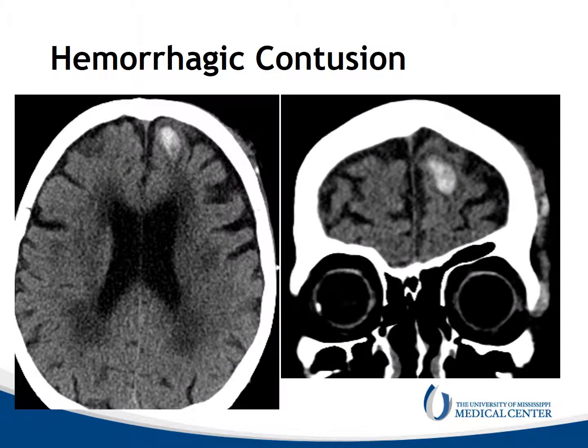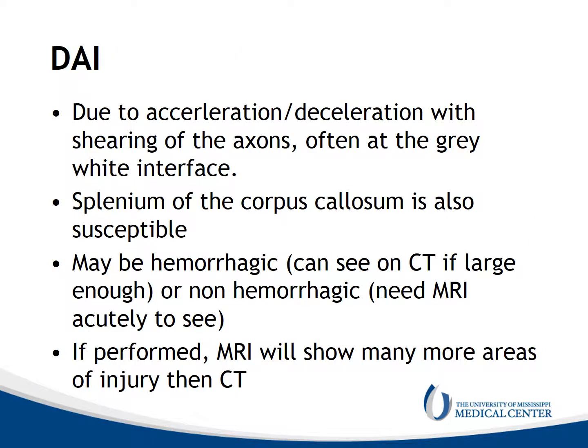Here's a hemorrhagic contusion in the left frontal lobe. This was traumatic. We can see the central hyperdensity reflecting the hemorrhage, and particularly on the coronal view, surrounding hypodensity reflecting edema.